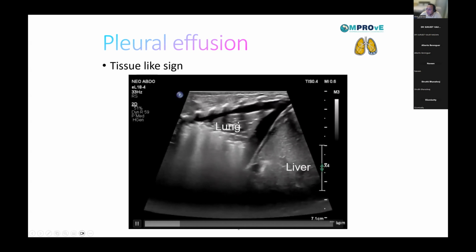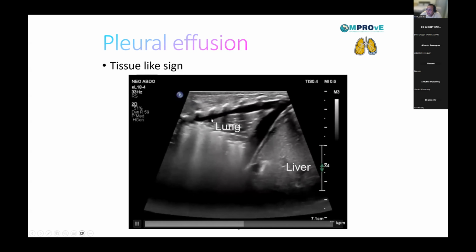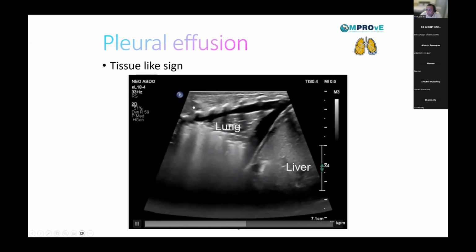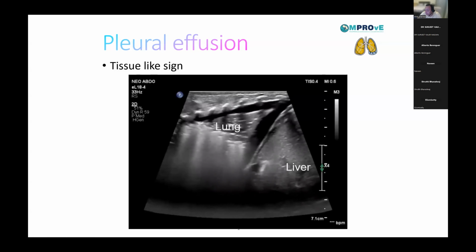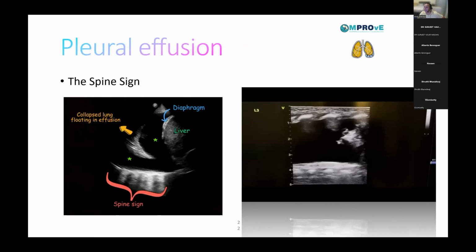Again, just look at how close the lung margins are. They nearly coincide. Now, if you decide to do a diagnostic tap in this particular situation, there's a very good chance you might end up puncturing this lung, and you might actually cause problems with what is a hydropneumothorax. So you can potentially make things worse.